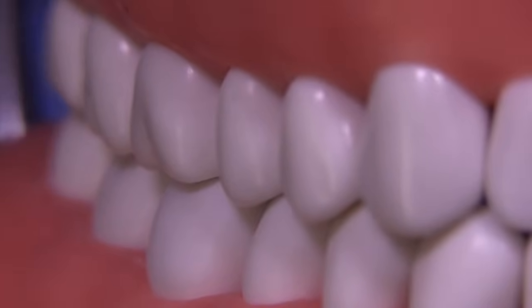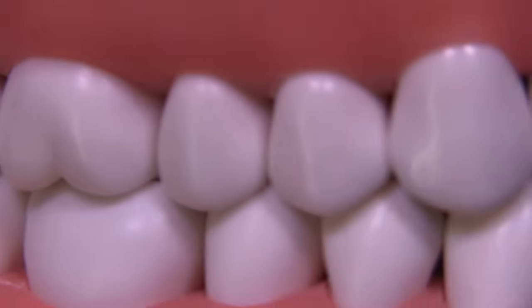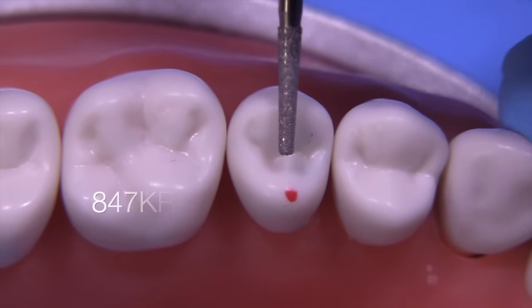The tooth we're going to use today is tooth number four on the Acadental typodont. I'm just marking the tooth so you'll see which tooth I'll be working on and as a reminder of where to place the bur when I'm shooting the video.